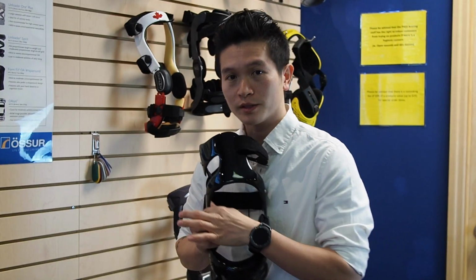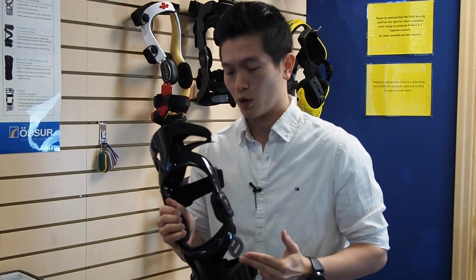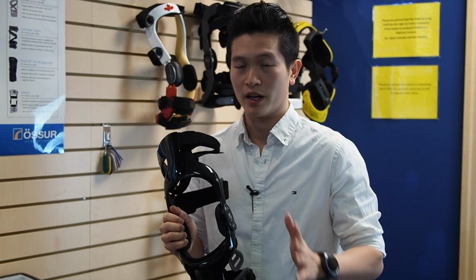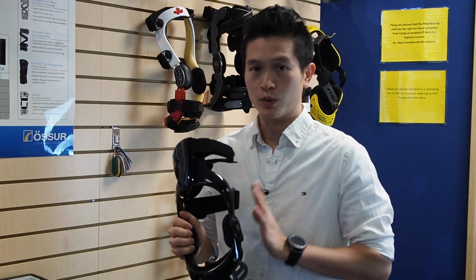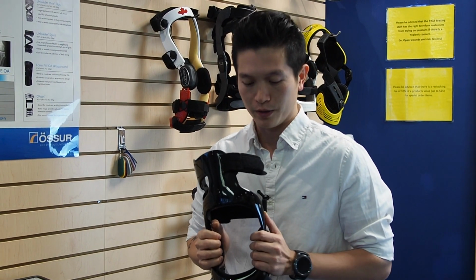When you go to a custom brace, some of the parts will need to be specially cut and sewed, so that takes a little bit longer to get. But again, all the soft parts to all of these braces are interchangeable and they can be replaced.